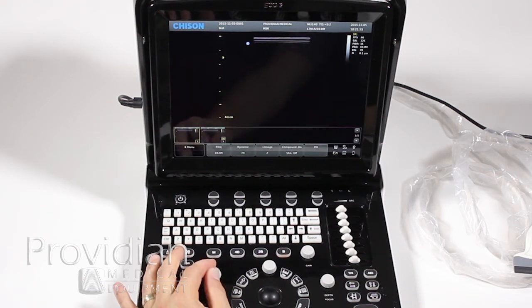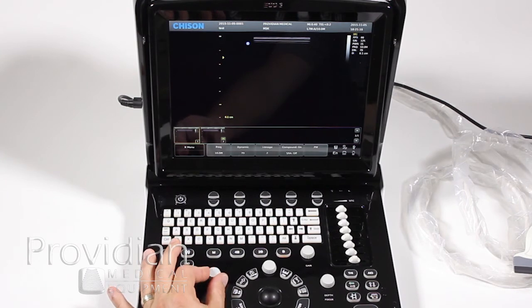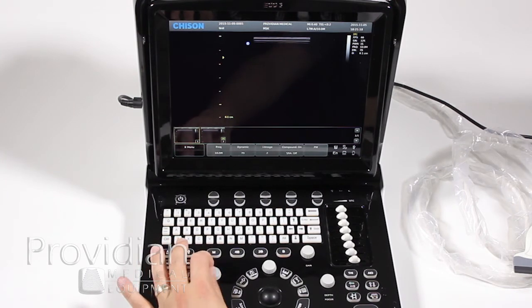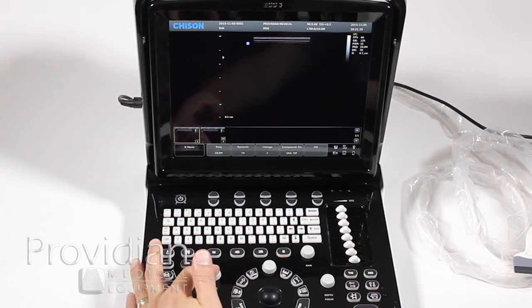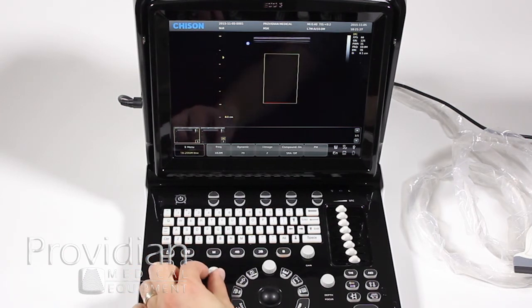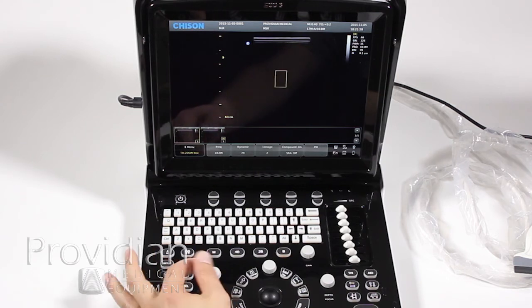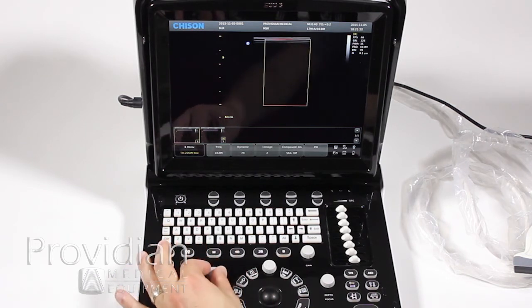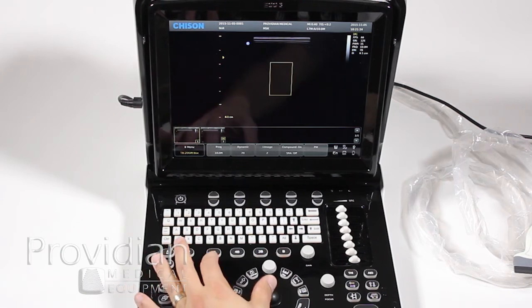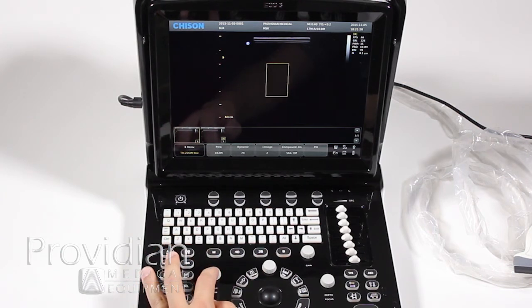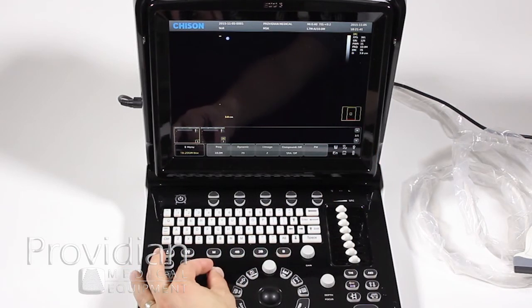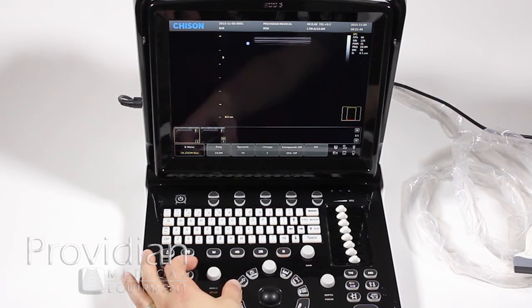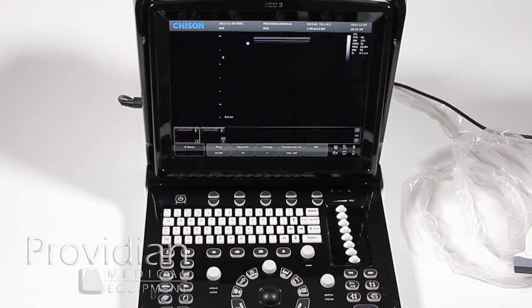Over here we have angle and zoom. The angle won't do anything in general 2D but will function in other modes. To zoom, click down and highlight zoom — here's your zoom box. You can increase or decrease by twisting the control and move it using the trackball. Click again and it will show exactly where you're zoomed in. You can increase or decrease that zoom, then hit exit to go back to regular 2D imaging.